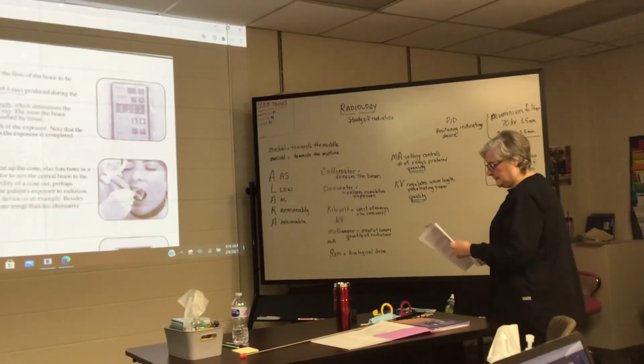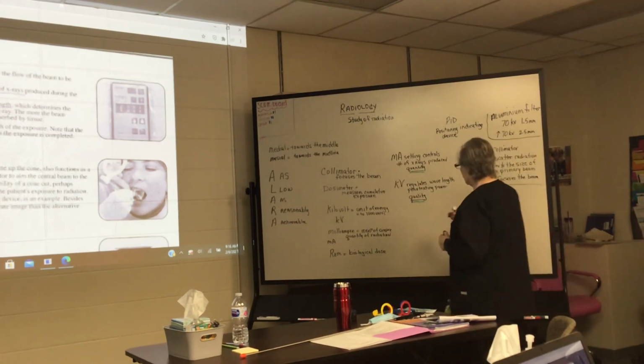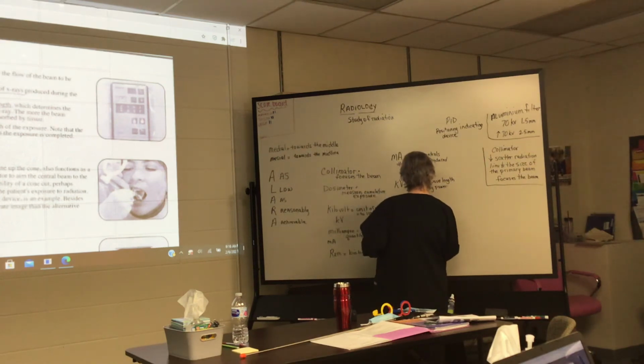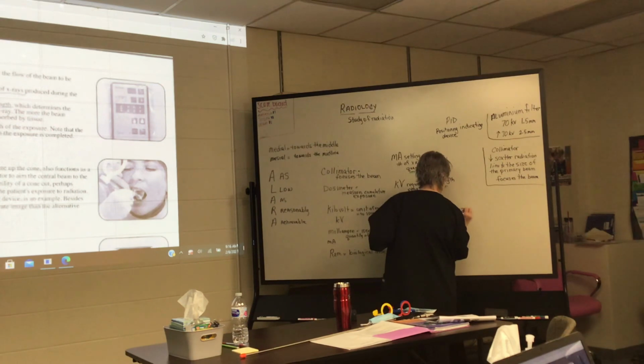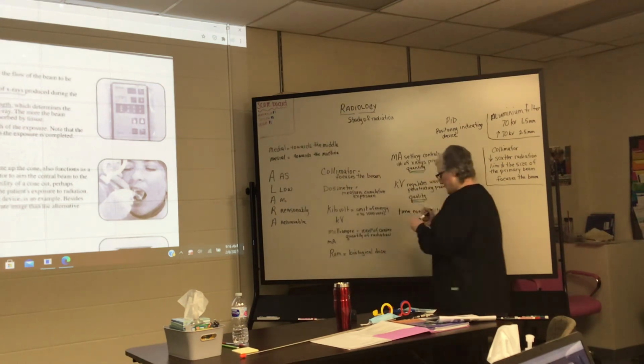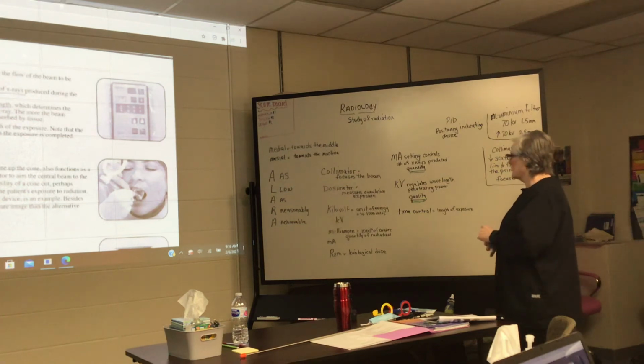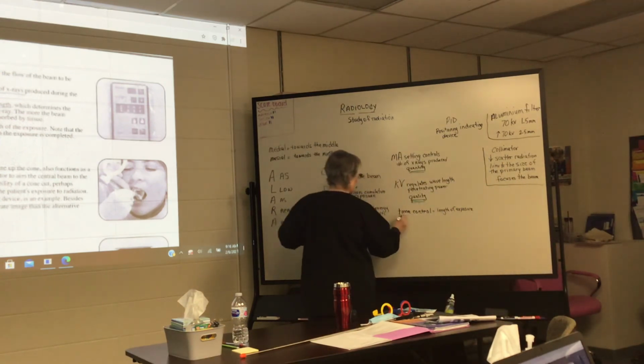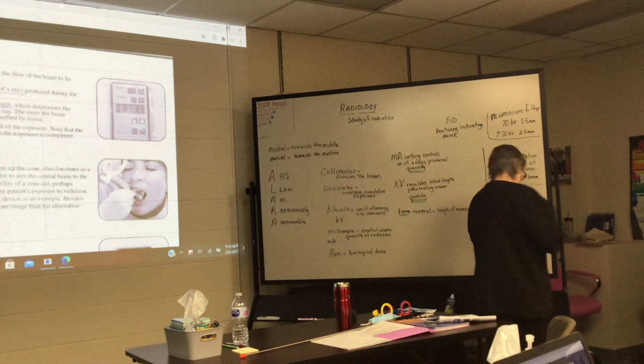The time control is another factor here. What do you think that controls? The length of exposure. Exactly. Most of the time, these things are preset. So the time control, the key word here would be time. Okay?